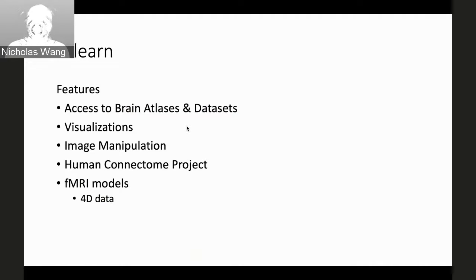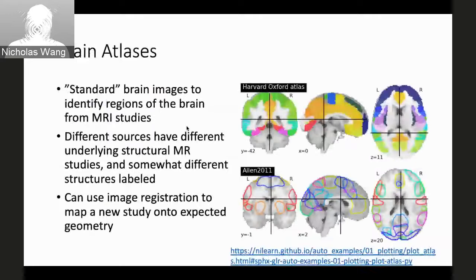And an important thing to know about fMRI is because it's an MRI which looks at a 3D space, but it also looks at this information and the change in blood flow over time, you're looking at four-dimensional data, which is always a little more tricky. Two-dimensional data is easier to handle than three-dimensional data, which is, again, easier to handle than four-dimensional data, which is always hard to visualize. So NILearn provides a lot of these toolkits for handling this four-dimensional imaging data.